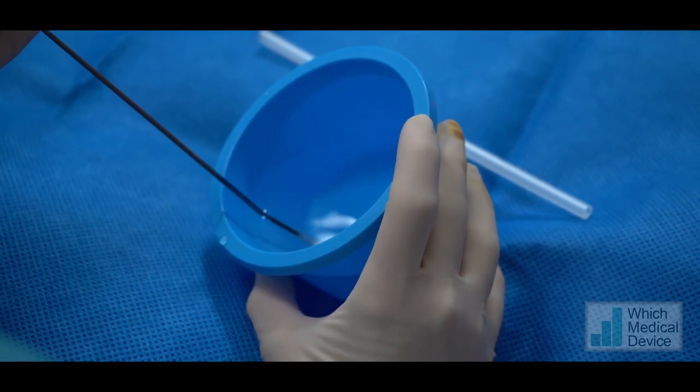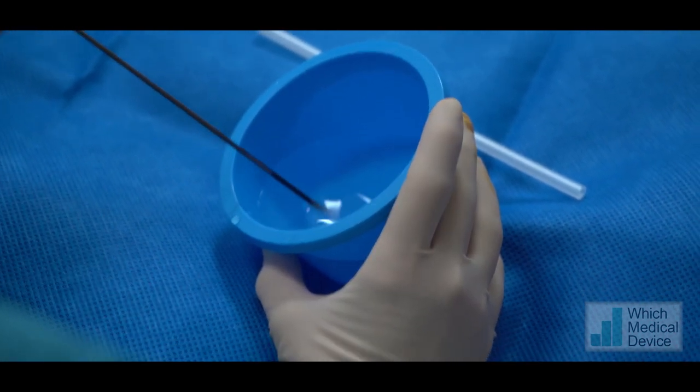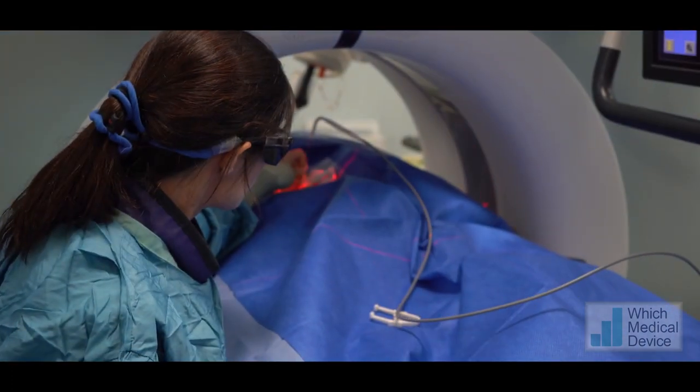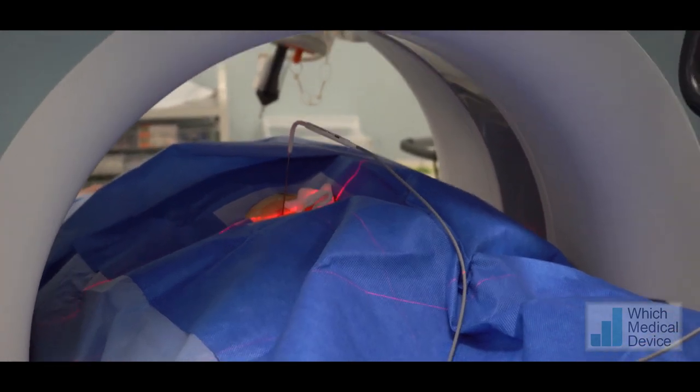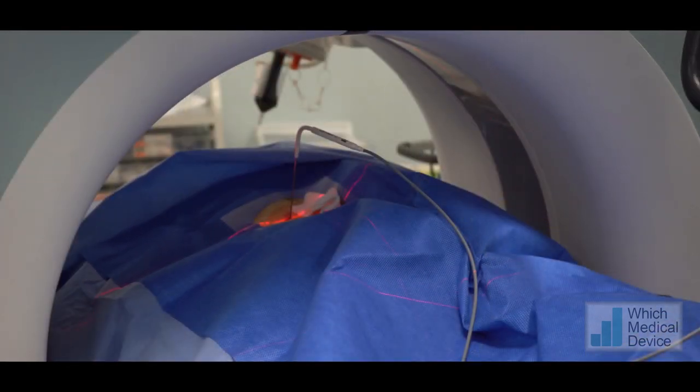You will see that it slowly forms a small ball of ice onto the end of the needle. Once we've done that, we position the needle within the patient. We often do this initially with ultrasound guidance because it's quick, but in this situation with the patient under general anaesthetic — where we can guarantee good breath holds in expiration — we place the needle with direct CT guidance, using intermittent CT slices. We first place the needle a few centimetres into the skin on the slice position where we've seen the tumour on the post-contrast slice, then confirm the position with further slices and advance the needle until it's in position.